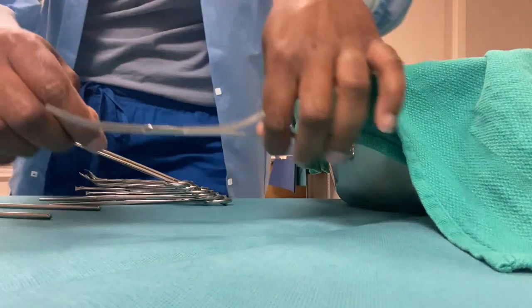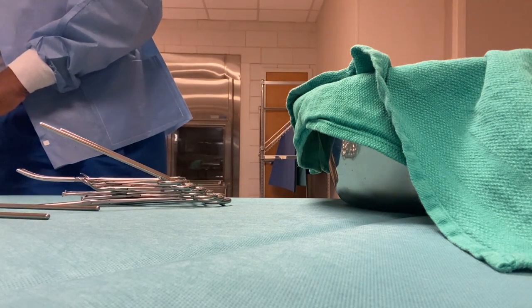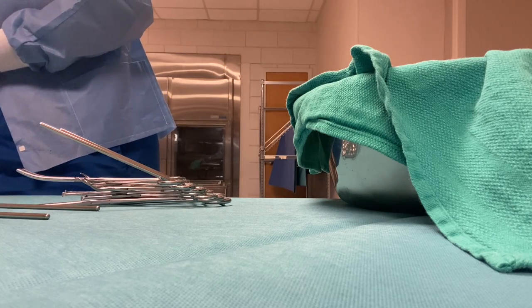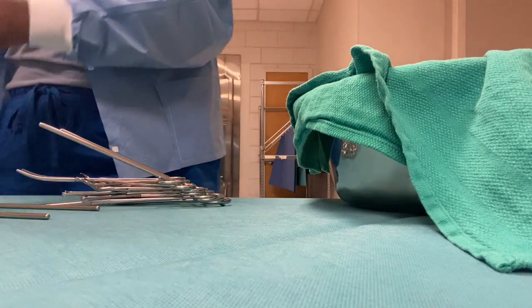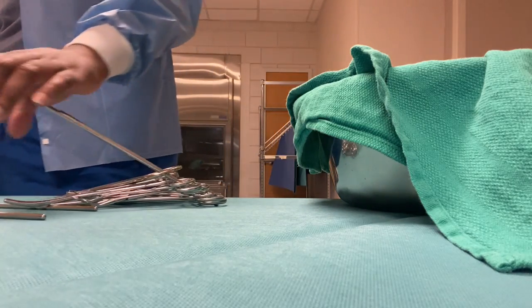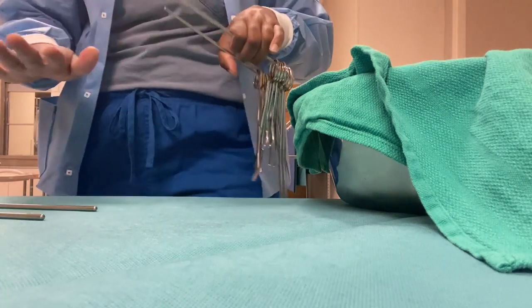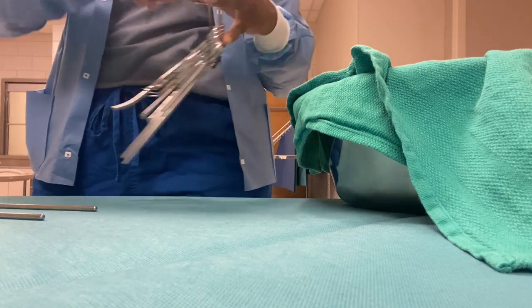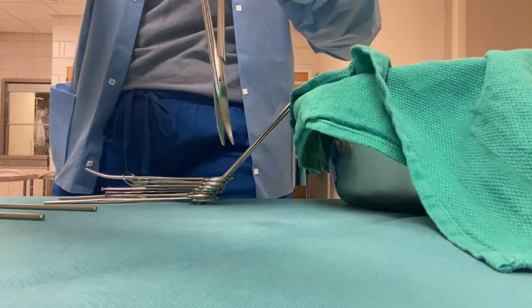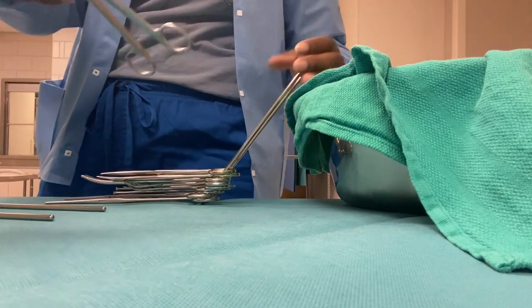Next is Kelly. One Kelly. First, male straights. Next, oh, see y'all messed up there. Anytime you see yourself mess up, and you put some before the next, all you have to do is take it off. It's best that you catch it before somebody else catches it. So really, what's next is curve Mayos. Then straight Mayos. Then my bandage scissors.